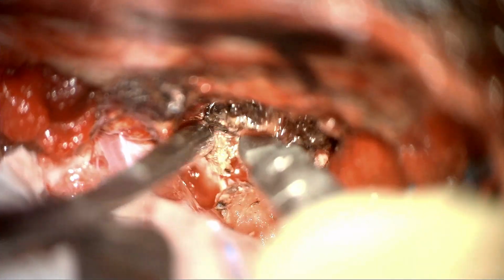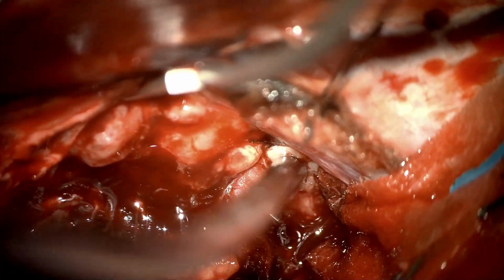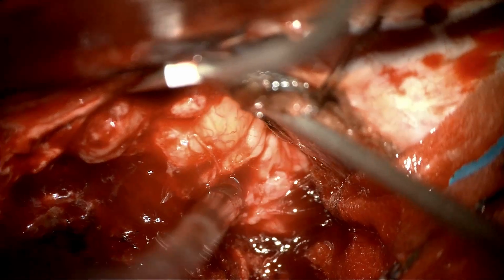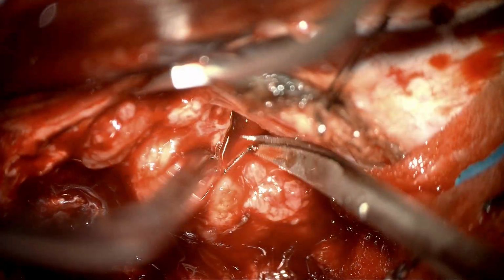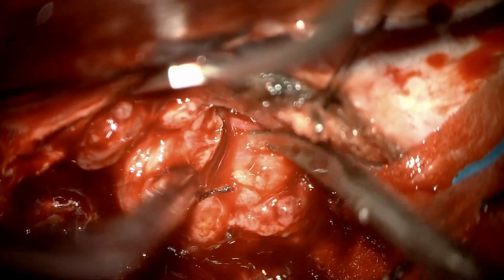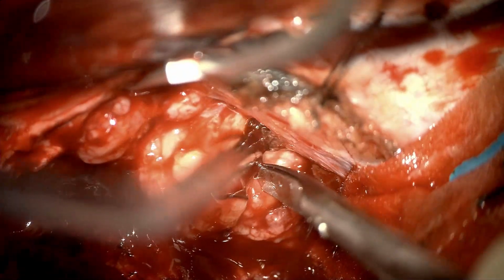We finally extend the cut over the tentorium to completely free the tumor margin. And now, using a Joseph number 4, I continue the blunt dissection and completely free the tumor margin superiorly.